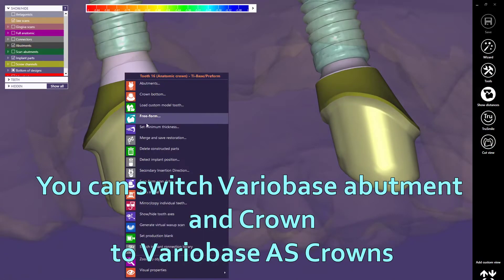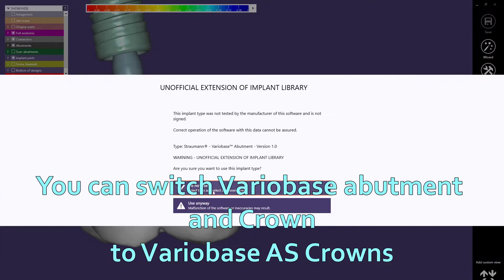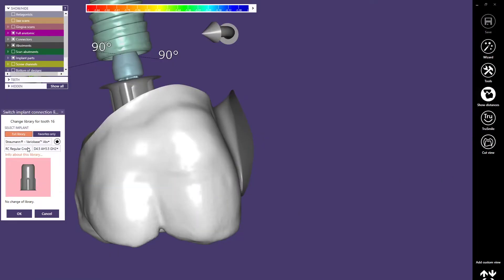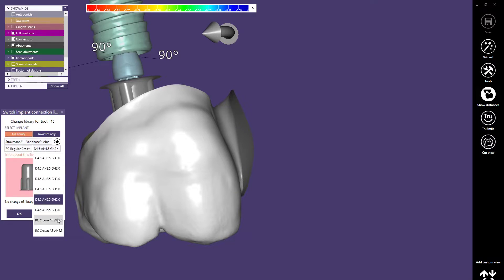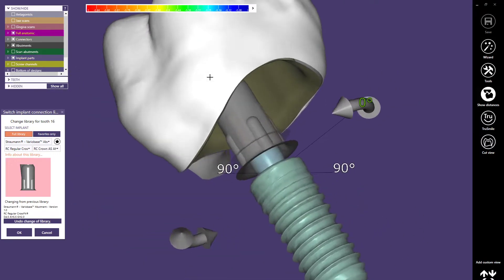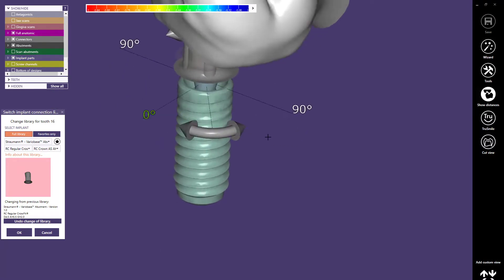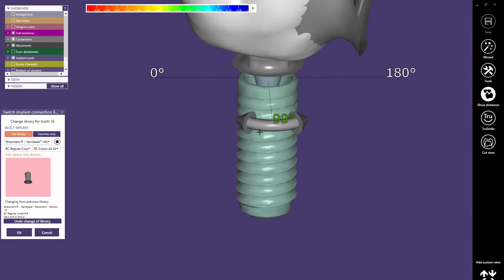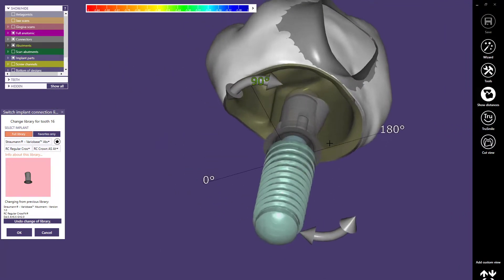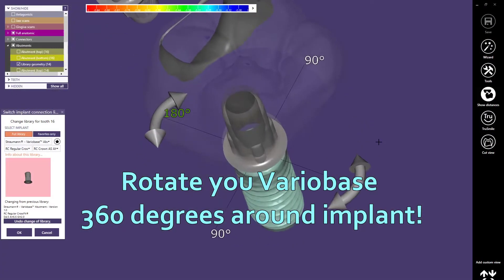You can switch Titanium Bases to pick the ones which you would like to use for your case. Then rotate them to change position as you need to.